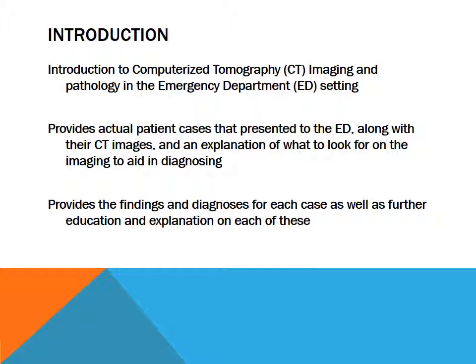It provides almost 70 cases of actual patients and their complaints, as well as the imaging studies conducted during their visit. It provides the findings and diagnoses for each case and provides further information and education about each of these findings.